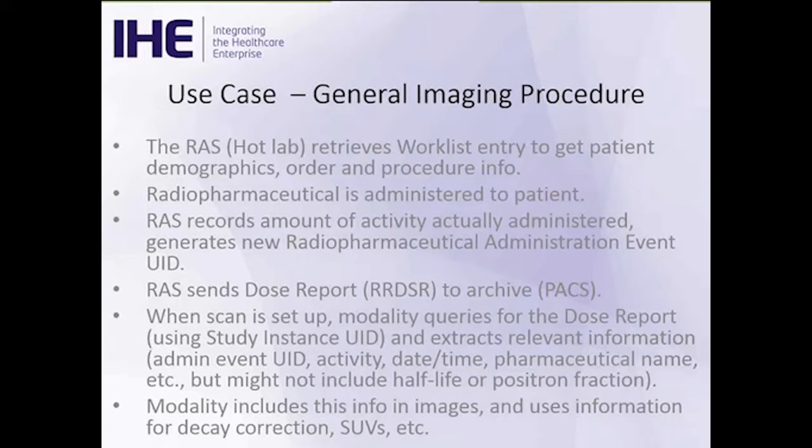So in that time, the dose has been administered to the patient. The report can be sent up to the PACS, and we'll see this in the next workflow diagram. So if you want to go to the next slide.